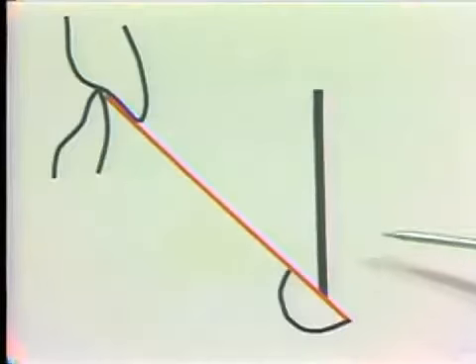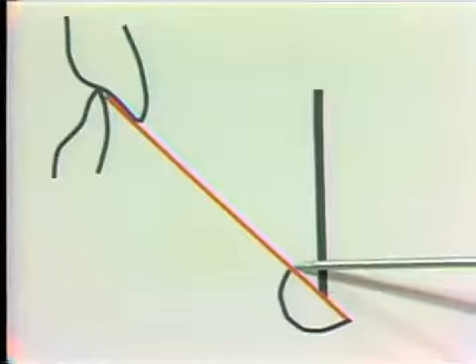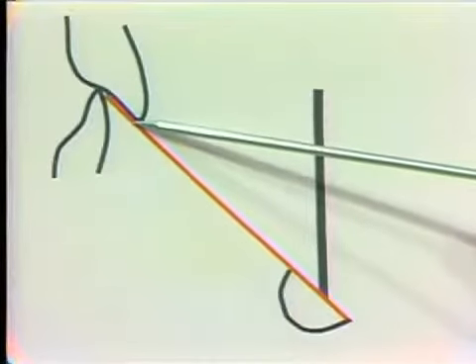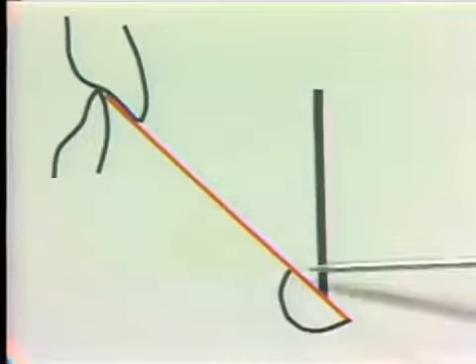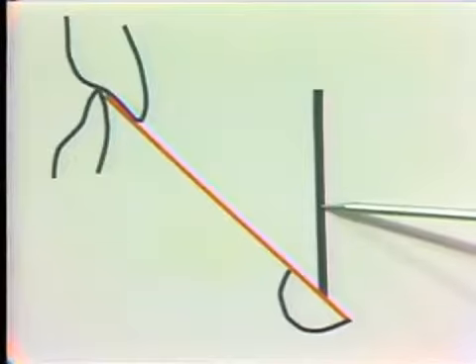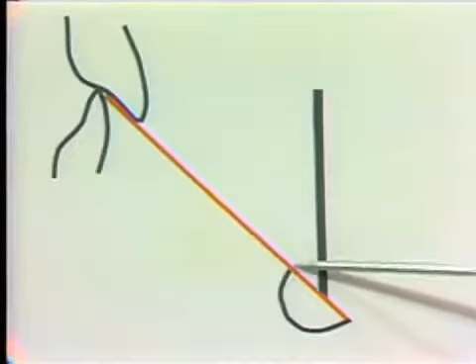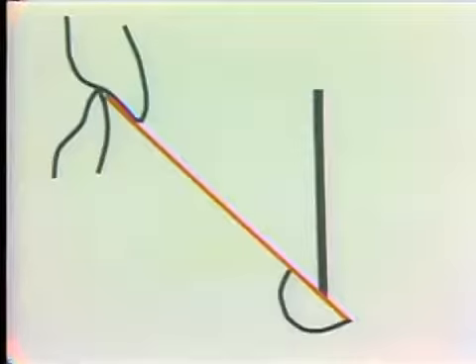You see here, this simulates the incisal pin of the articulator contacting the incisal table. The angle that the lower incisal edge would traverse across the lingual surface of the maxillary central incisor should be simulated in the incisal table, so that when we move the articulator in the protrusive excursion, that is moving the upper member of the articulator backward, as it rides up this surface, it would duplicate the same angle as here in the mouth.